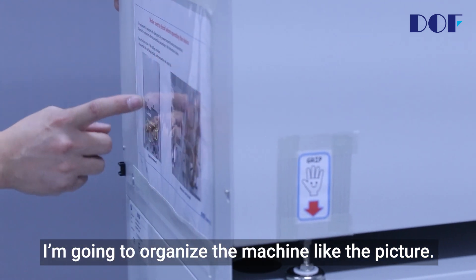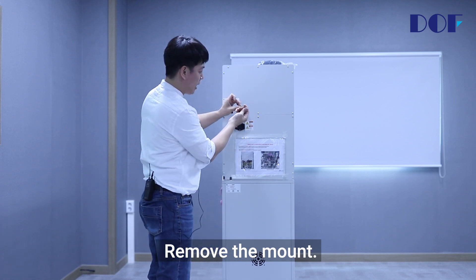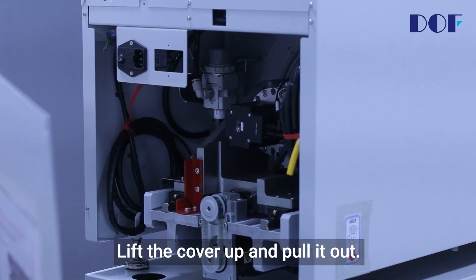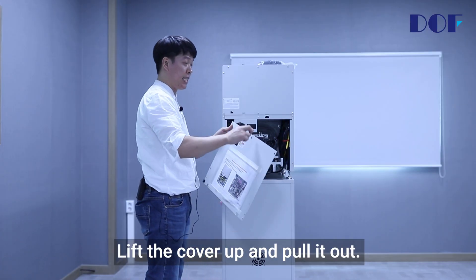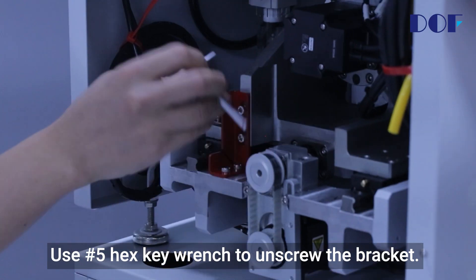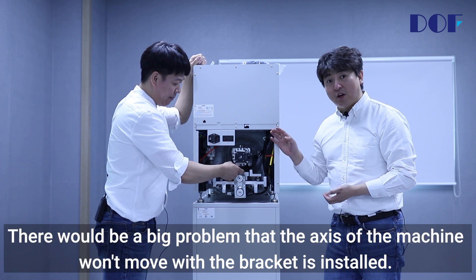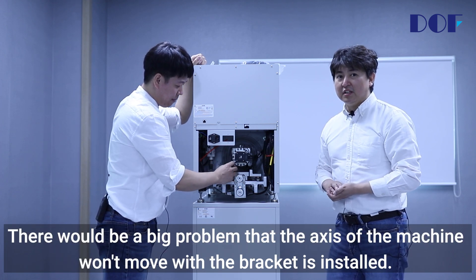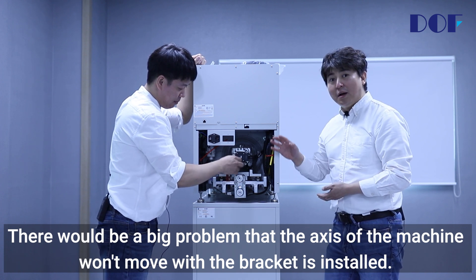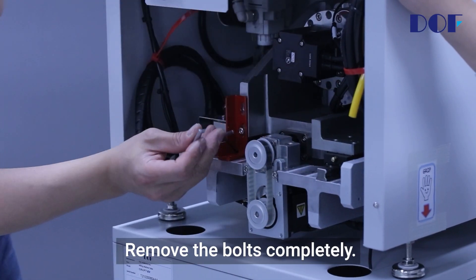I'm going to organize the machine like the picture. Remove the cover and the mount — lift the cover up and pull it out. You must remove this red bracket first. Use a number 5 hex key wrench to unscrew the bracket. Removing the bracket is very important: if the bracket is installed, the axis of the machine won't move. You must remove the bracket before running the machine. Remove the bolts completely.